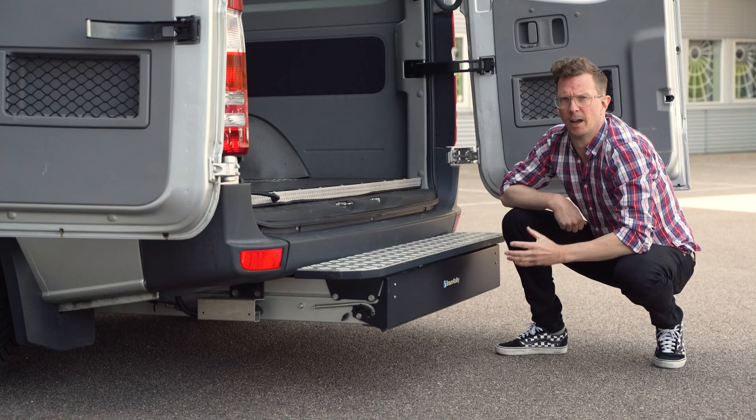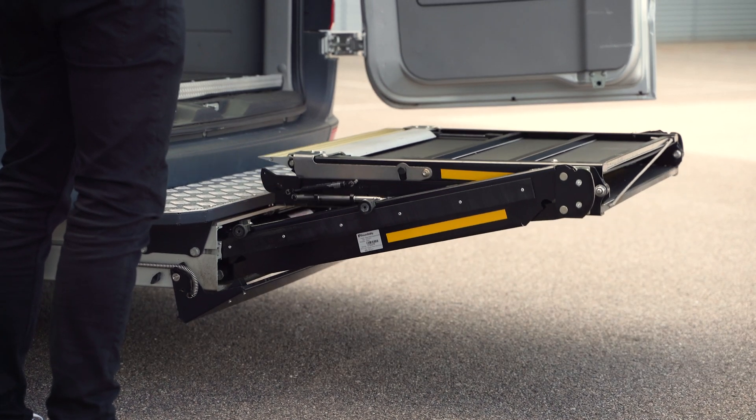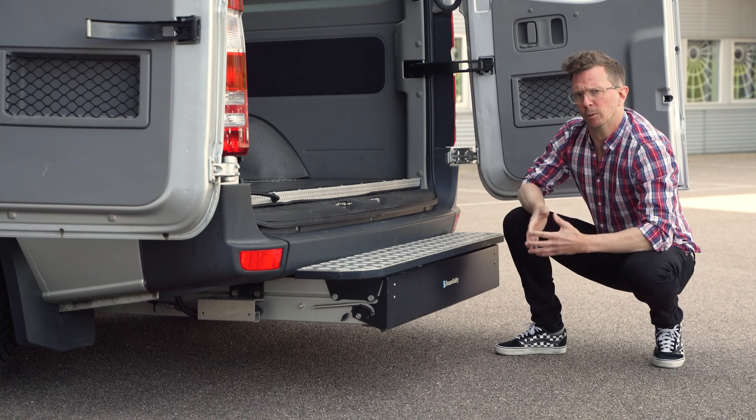The cassette design has several benefits. Mounted under the floor, it allows you to make best use of the interior. It also doesn't block access to and from the vehicle.